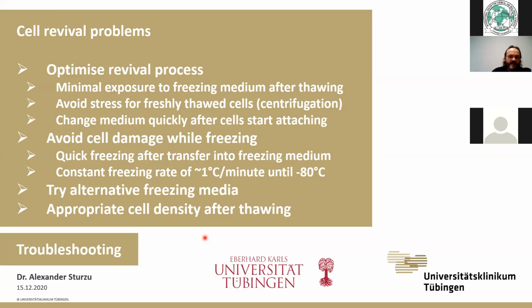And personally, I have found that extended exposure to the medium containing the debris from the cells that did not survive the freezing, and the freezing medium, if we leave this overnight, the cells don't like it this much, but if you change the medium as soon as they have started attaching, this is the best.